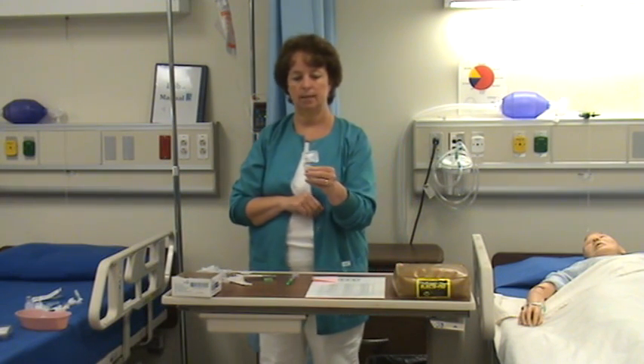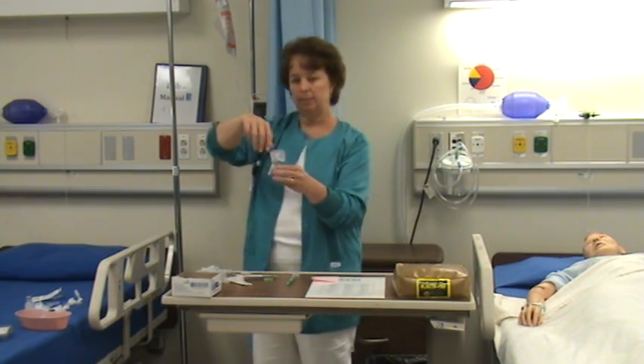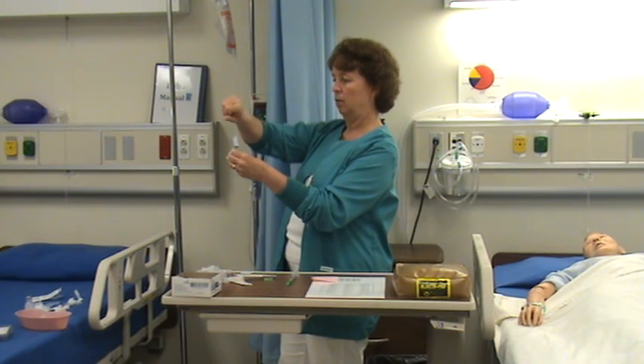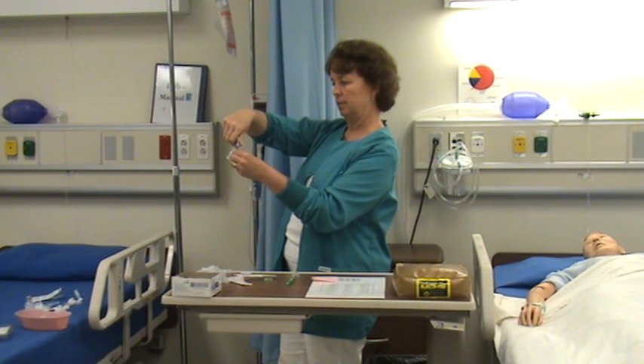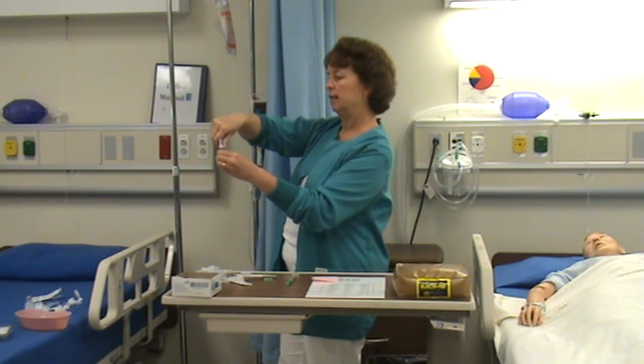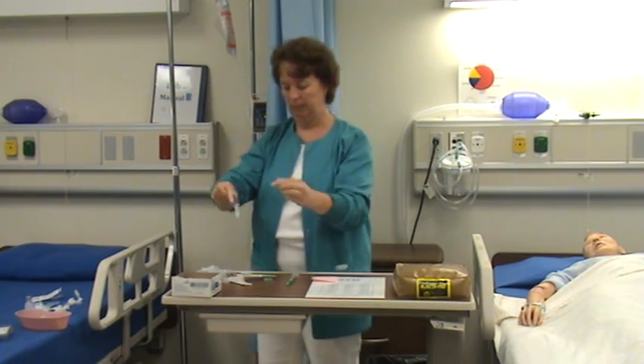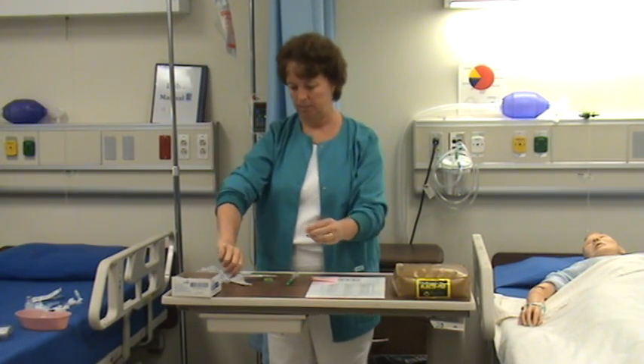You can also have gloves on — that's helpful. When you break the ampoule, you're going to basically just snap it — this way or that way. I prefer to snap it away from me. You hold it straight and then give it a quick snap, and then that top piece goes into the sharps container.